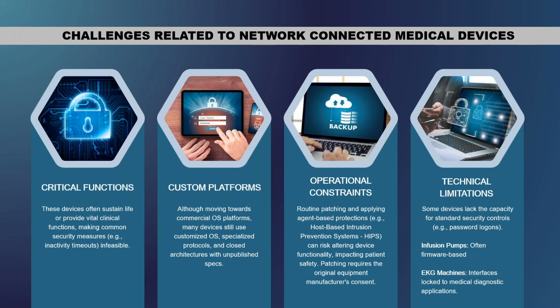And then the custom platforms as well, moving towards commercial OS platforms like Windows, or sometimes the manufacturer will have embedded systems. You don't know that, or if they're using Linux systems, more and more manufacturers are doing a black box, so you don't know what is actually going in there, and then you constantly ask, well, I need to know what's actually in your software, so if there's any issues, we can address that.